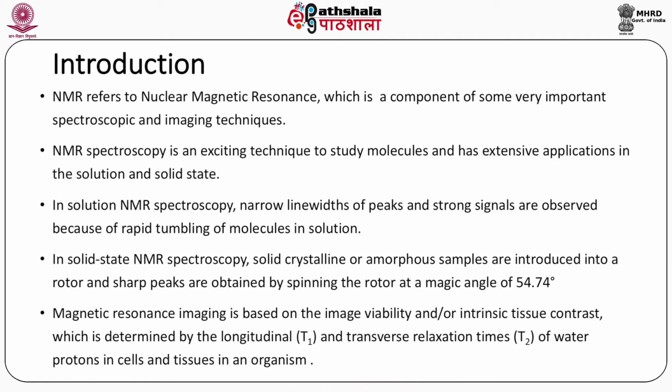Magnetic resonance imaging is based on the image viability and/or intrinsic tissue contrast, which is determined by the longitudinal and transverse relaxation times. They are called T1 and T2, and we will learn about them later, of water protons in cells and tissue in an organism.